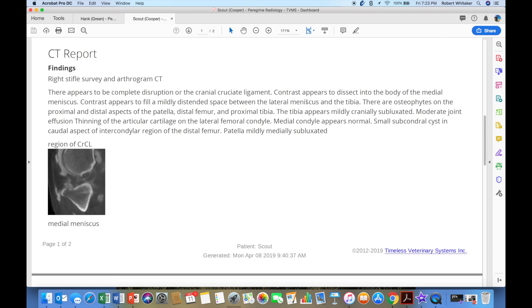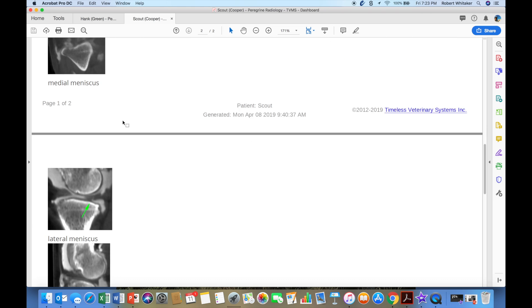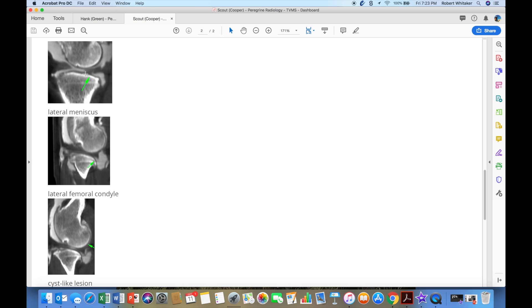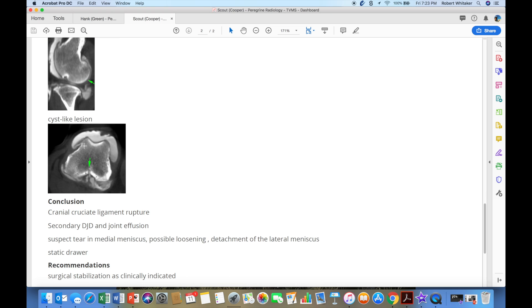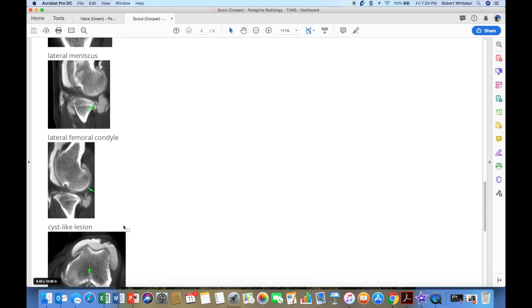The radiologist also comments that contrast appears to fill a mildly distended space between the lateral meniscus and the tibia. There are osteophytes on the proximal and distal aspects of the patella, distal femur, and proximal tibia. Moderate joint effusion. When we look at the meniscus, we can see what he's talking about — a little bit of a contrast bridge that maybe shouldn't exist. There's also a cyst-like lesion he indicates. His conclusion: cranial cruciate ligament rupture, degenerative joint disease, joint effusion, suspected tear in medial meniscus, possible loosening and detachment of lateral meniscus, and surgical stabilization clinically indicated.